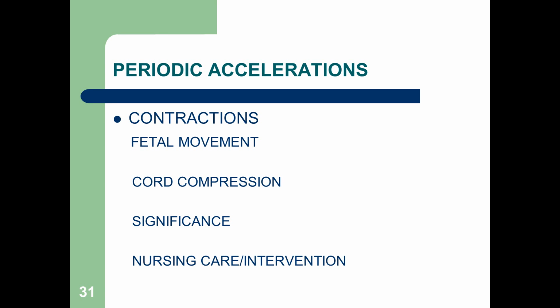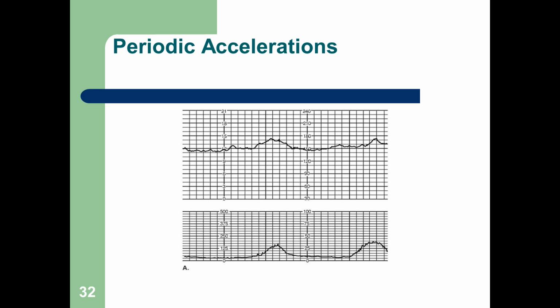Continue to monitor. And you're going to learn in a little bit when we talk about late decelerations and early decelerations, you do what's easiest first, and that's change the position. Here are some periodic accelerations. Here's your contraction, and here's the elevated fetal heart rate. There we go. No, looks like some early.